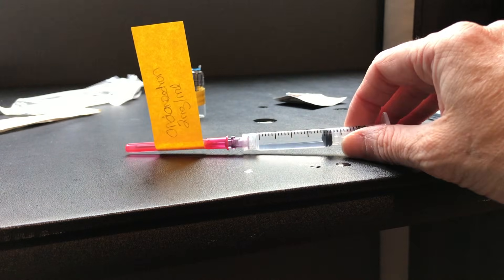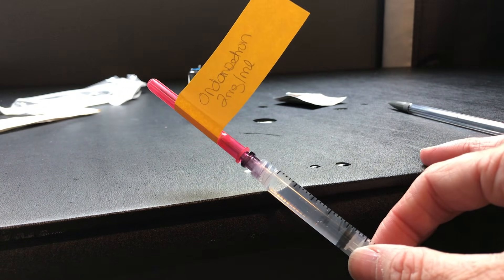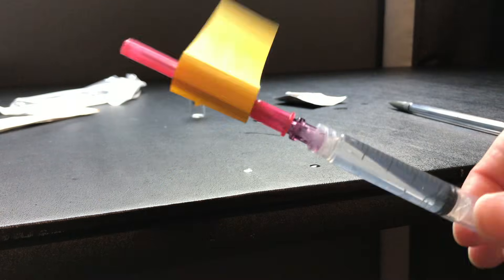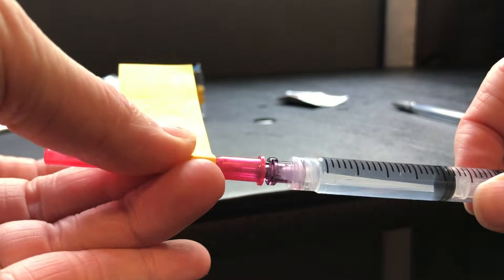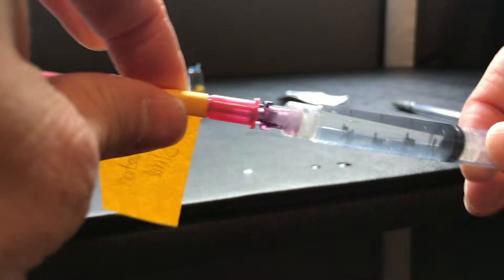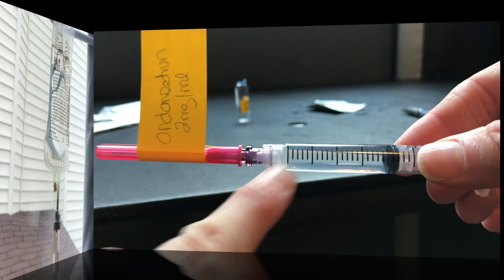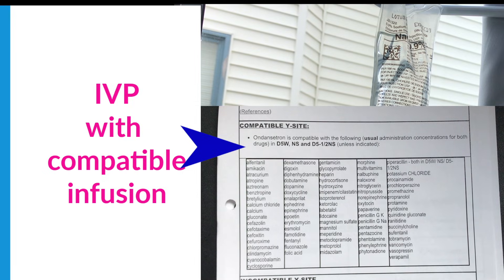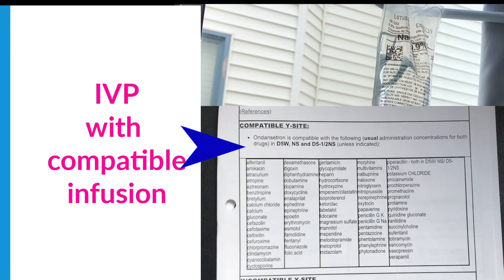You want to label your syringe before you go into the patient's room. I've labeled it ondansetron 2 milligrams per mil so there's no confusion. I like to put the label on the hub cap so that when I remove it I'm not losing sight of the graduation lines. At the patient's bedside, we have normal saline infusing.